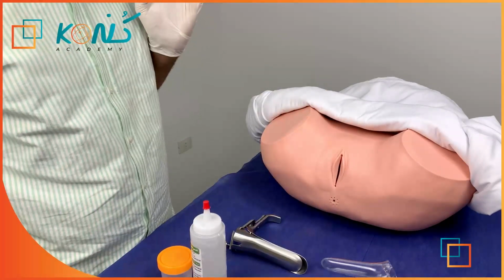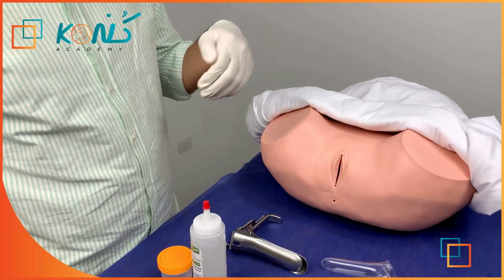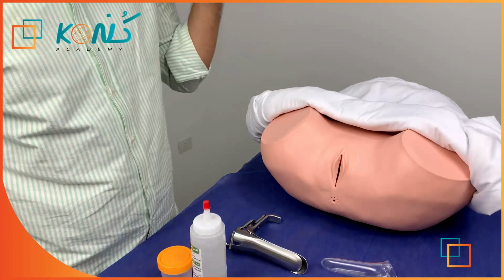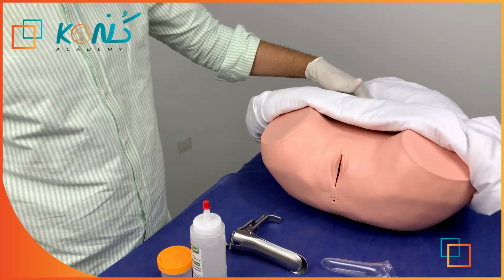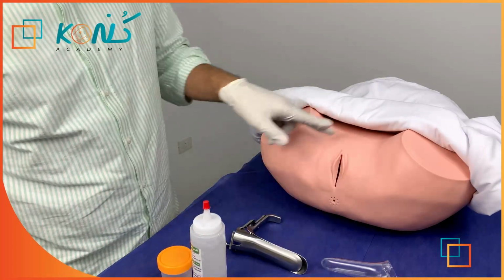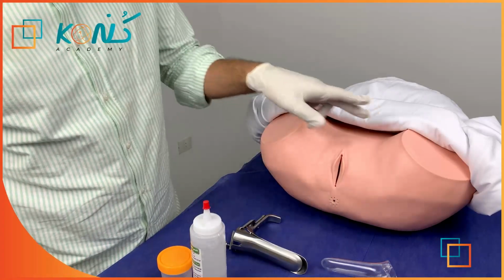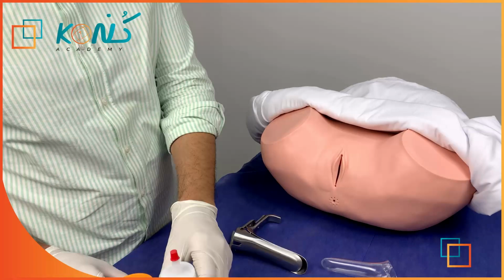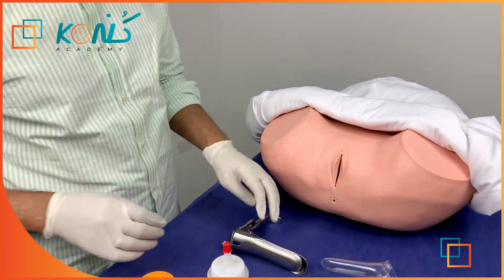A gentle reminder for you: we have verbalized about observations and we have verbalized about the abdominal examination for our patient, but we didn't do them. So after having a look and after asking my patient to cough for me, right now I will come to the point of the speculum examination.